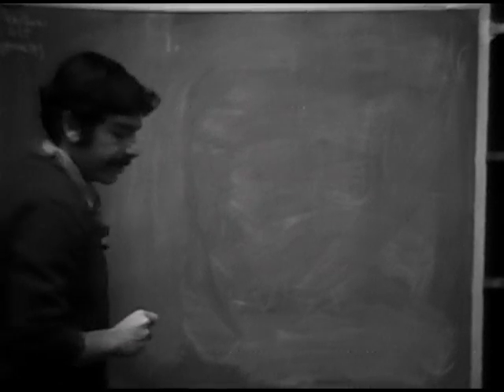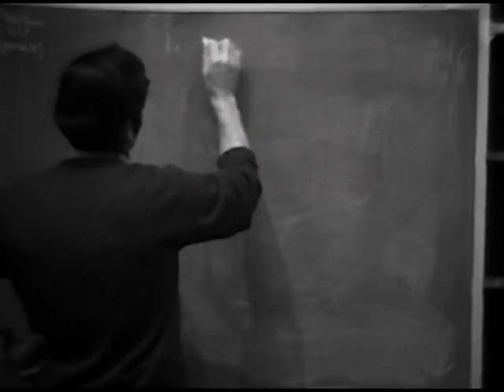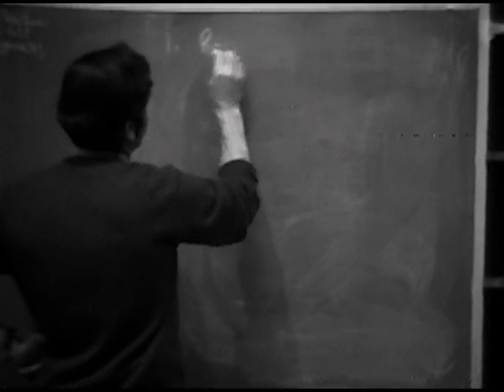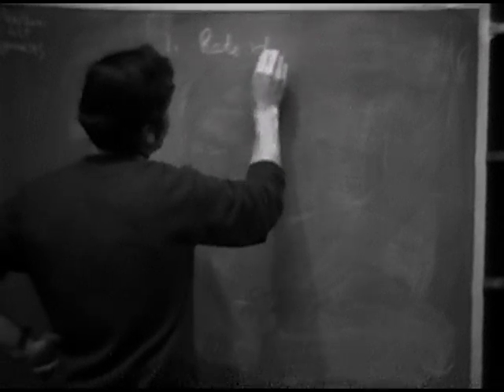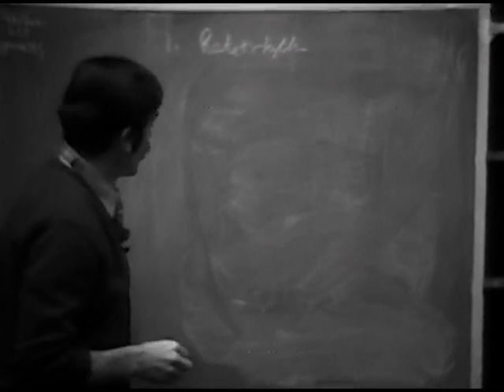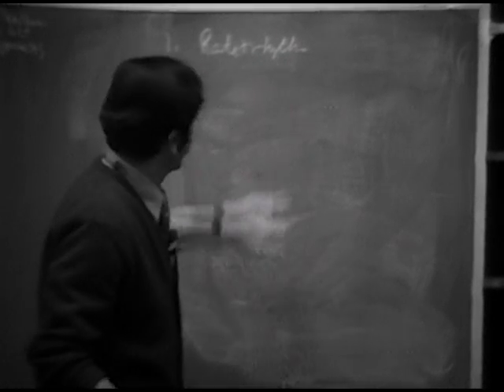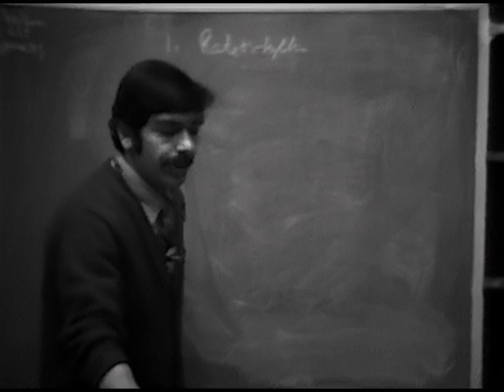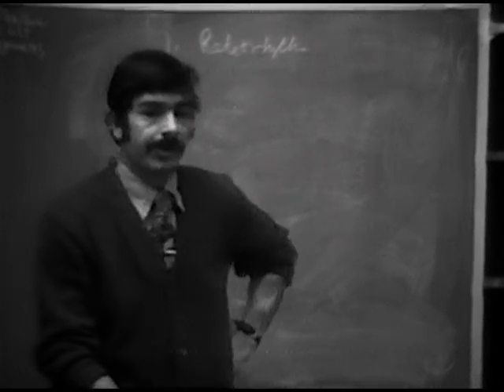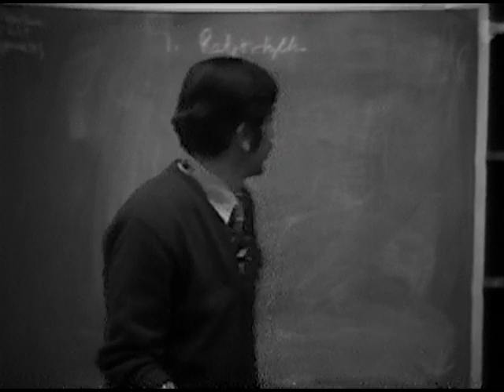The routine that I found helpful, and suggest, is that the first thing you do is look for the rate and the rhythm. We all know how to determine heart rate by now. If you're dealing with an arrhythmia, this is the time to get your calipers out and decipher that arrhythmia.